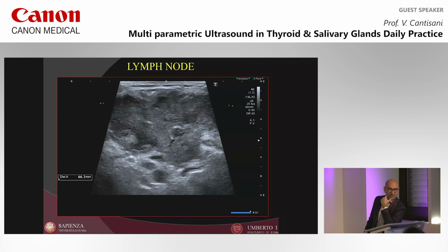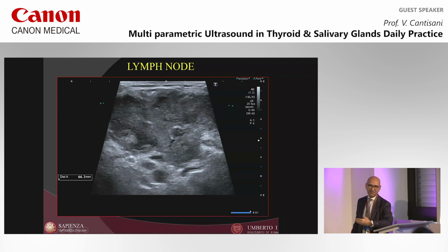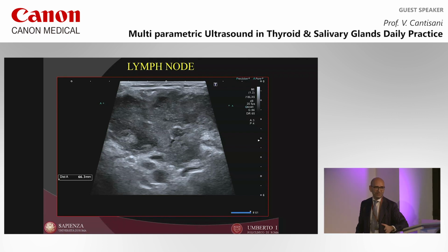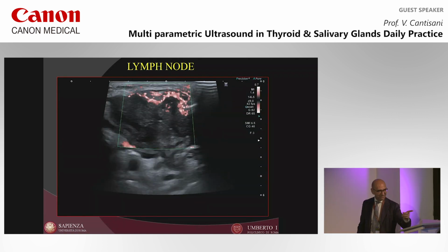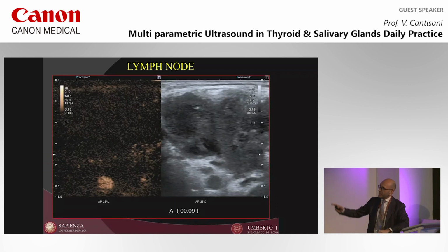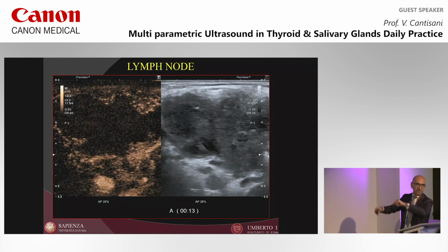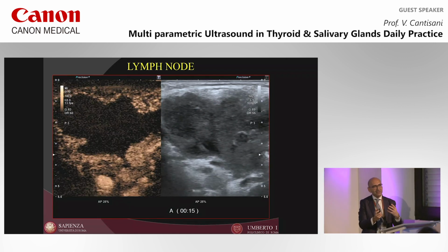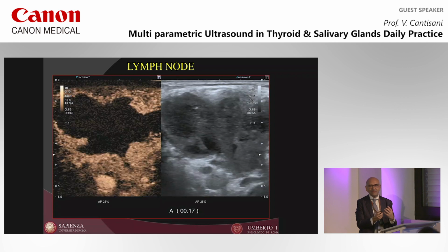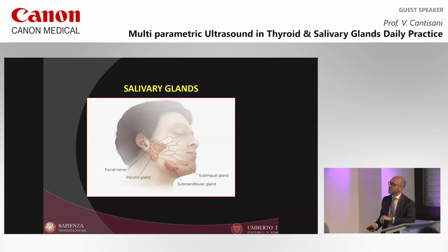what could be this diagnosis? Okay, clinical scenario, you're right. Fever, intense fever. And this was a tuberculosis case, and I made this diagnosis only by looking at it. Look at the vascularization. It looks like a cavern. So this is really the typical sign of tuberculosis.